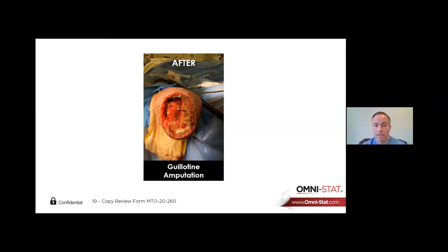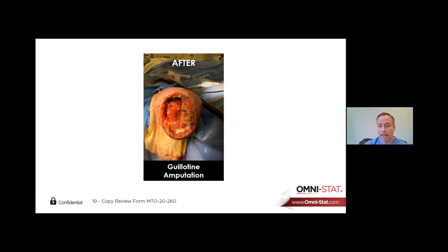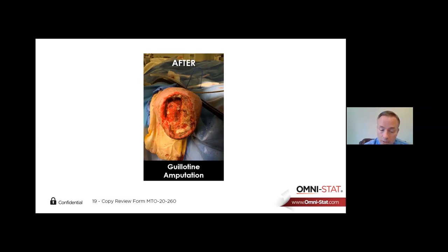This patient ended up with a Chopart amputation. You can see the calcaneus at the bottom with exposed tissue and a lot of bleeding. He had been revascularized and was on anticoagulation — I didn't want to stop it and I didn't use a tourniquet for this. Afterwards, I applied OmniStat, and once the bleeding is controlled, we put a wound VAC over the top.